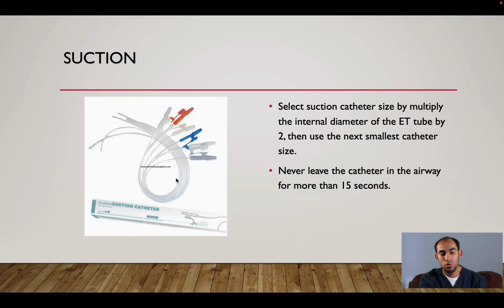Okay, now we will go to suction. Suction is very important to clear the airway. As you see here in the picture, there are different colors and different sizes. It is color coded. How do we choose the right size for the patient?